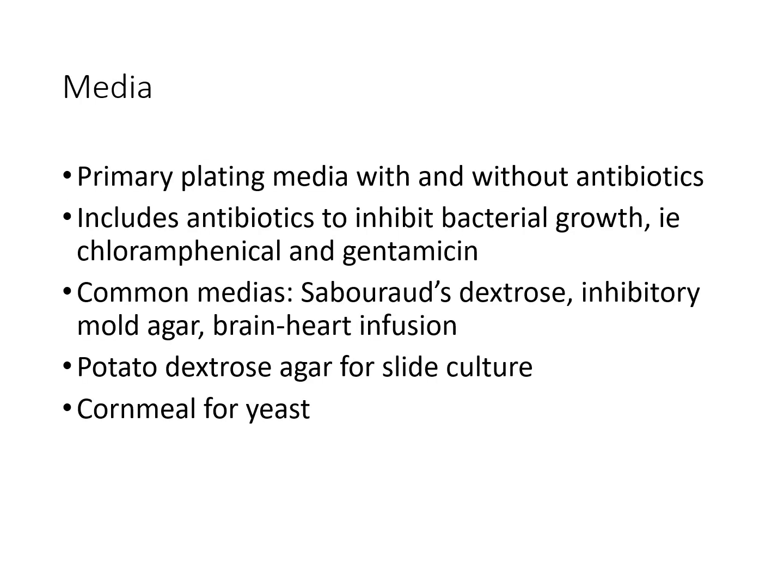Primary plating media for fungi are essential for isolating and growing fungal organisms from clinical or environmental samples. Some media are formulated with antibiotics such as chloramphenicol and gentamicin, which inhibit bacterial growth and prevent contamination that could otherwise overshadow fungal colonies. Common media used for fungal culture include Sabouraud's dextrose agar, or SDA, inhibitory mold agar, or IMA, and brain heart infusion agar, or BHI.